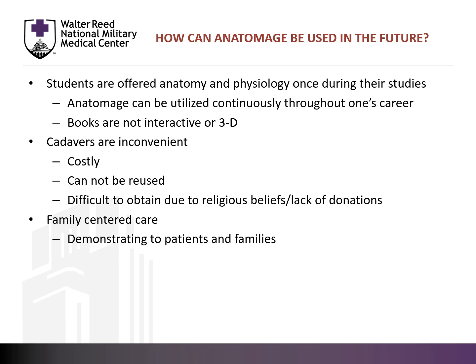Is technology the future? And will Anatomage take the place of cadavers in the anatomy lab? Will Anatomage be disruptive technology? For many of us, anatomy and dissecting a cadaver was a rite of passage. However, there are constraints associated with cadavers. The Anatomage table will bring capabilities to learners that did not have resources prior.